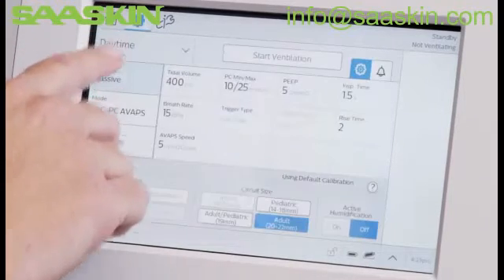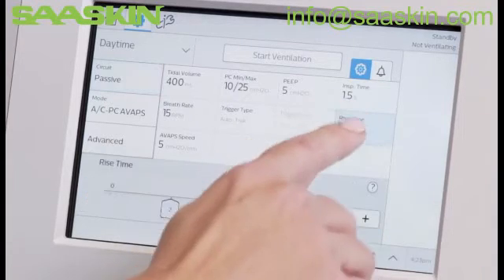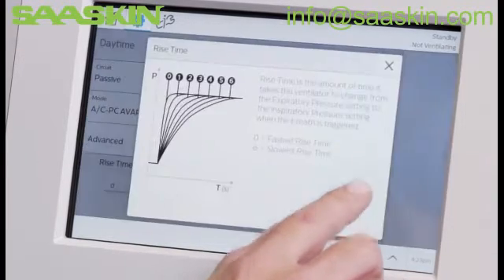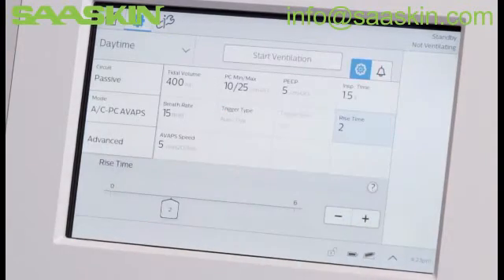Next to the Home window is Settings, where you can enter Prescription and Alarm Settings. For more clarification on a setting while entering a prescription, press the question mark icon for Help. To close Help, press the X.